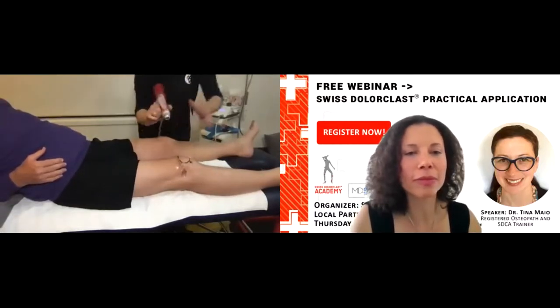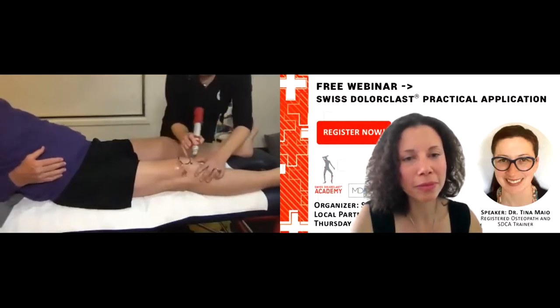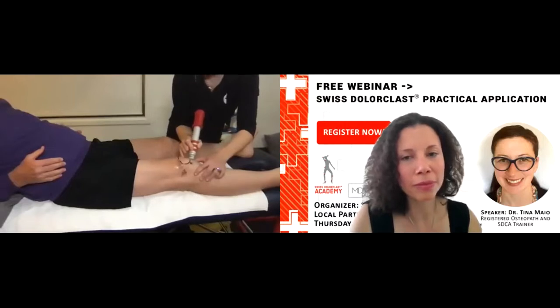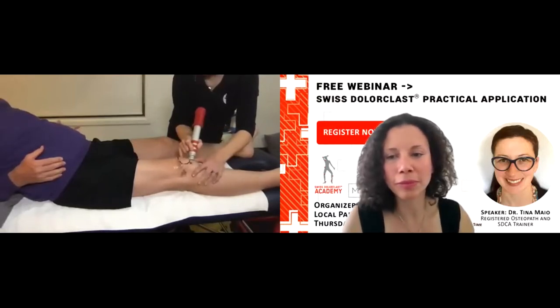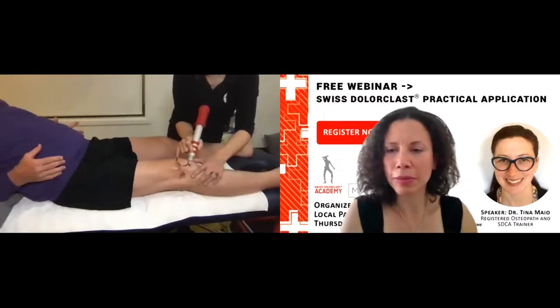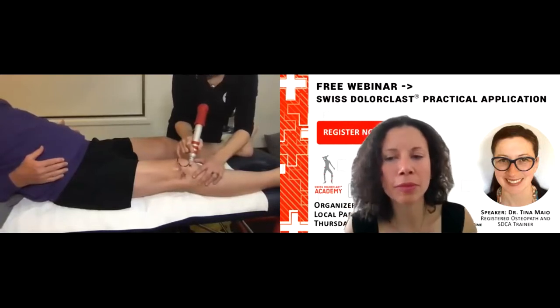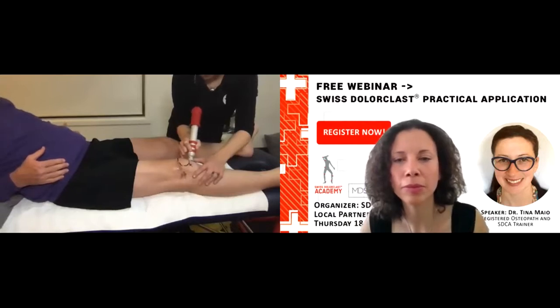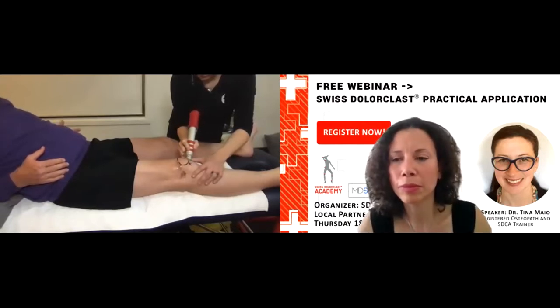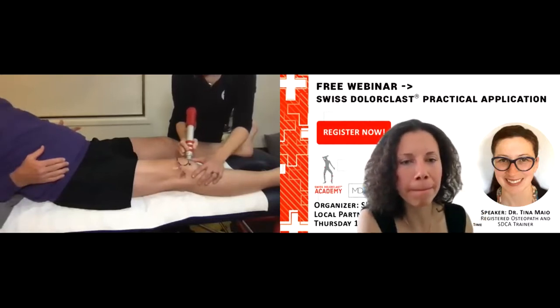And then we're going to come at the bottom here. You okay? How's that? That's the most painful. So breathe, just try and relax as much as you can. Let me know when it starts to ease. So very common that the medial side has more compression, more wear, and more pain.